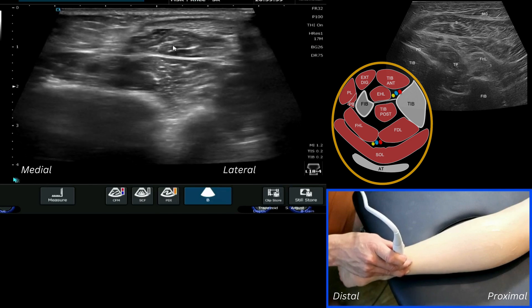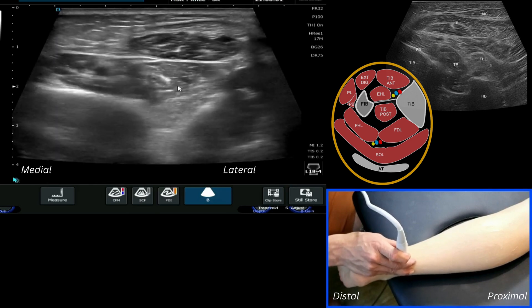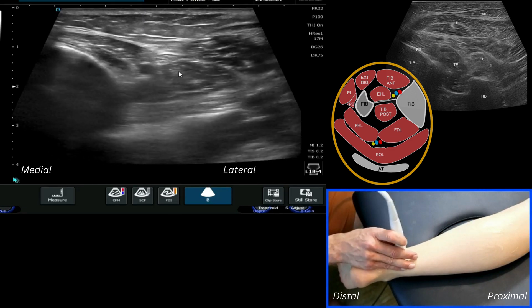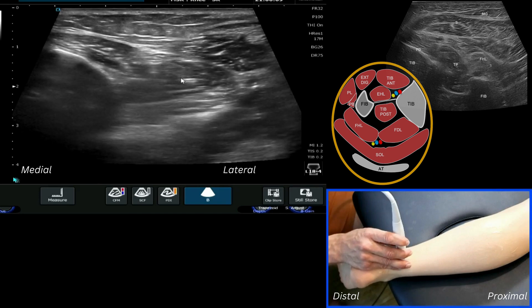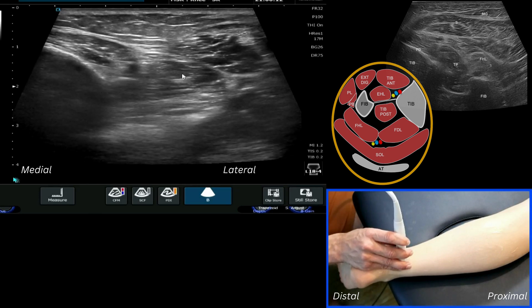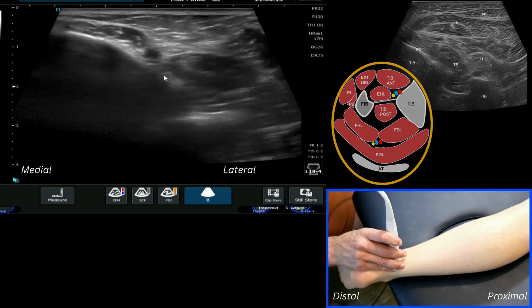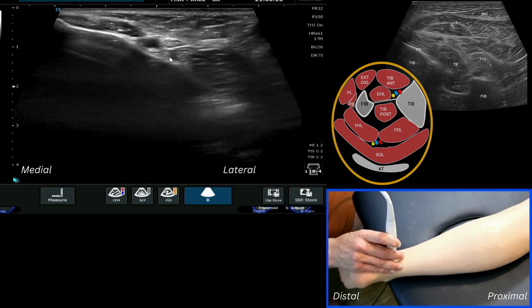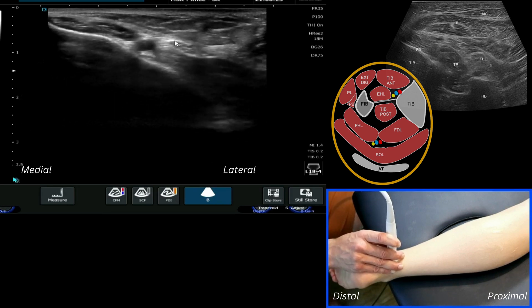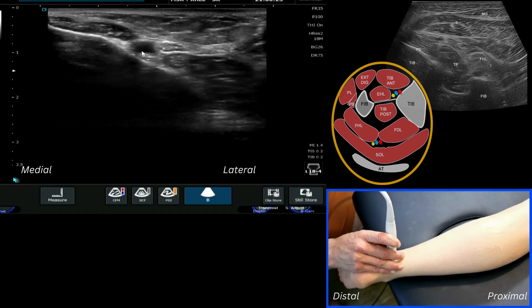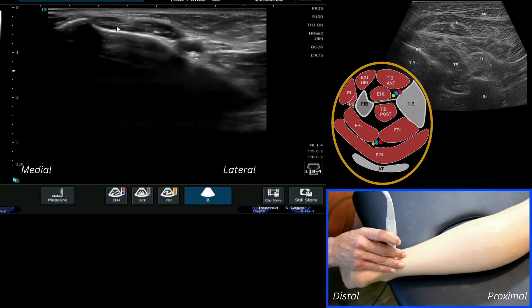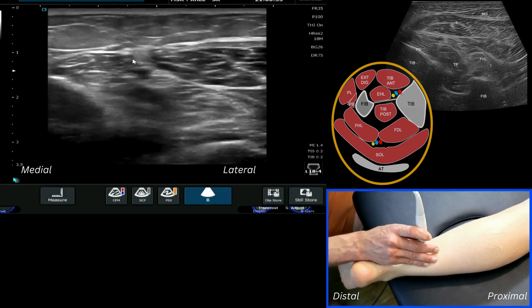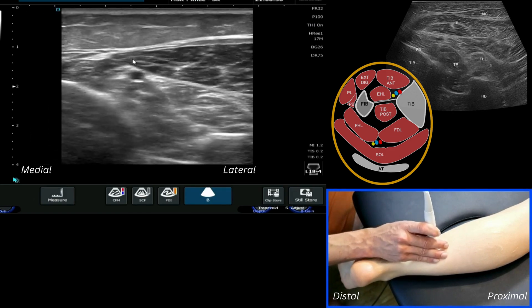Keeping going down, the Achilles shrinks, the soleus is present, and we see FHL also shrinking in. We have to just roll our probe around a little bit more medial to see this nicely and to make sure we're not getting anisotropy. We see the tendon starting to form, the remaining FHL muscle belly as we come into the medial ankle region — still got FHL here. We can get the patient to wiggle their toe again; you can see it very clearly. There's your tibial nerve, your posterior tibial artery, then we've got digitorum and the tibialis posterior tendon.